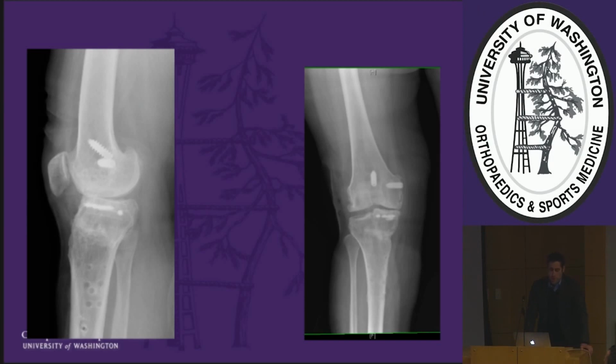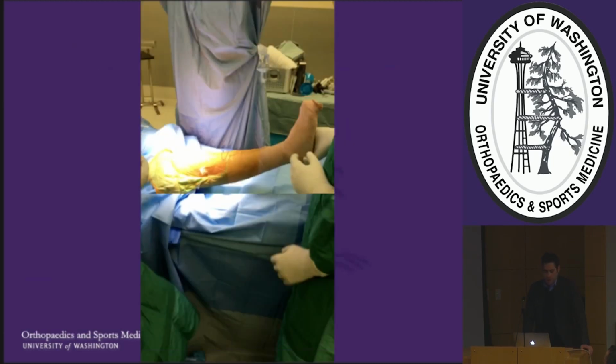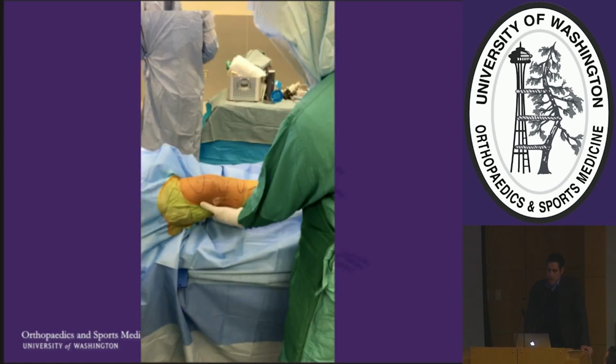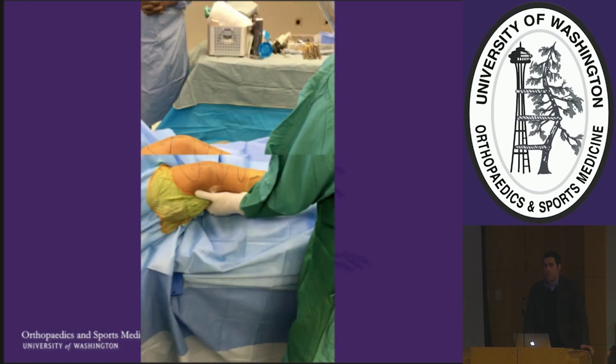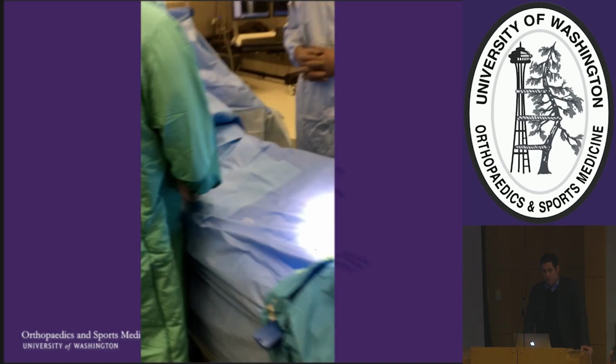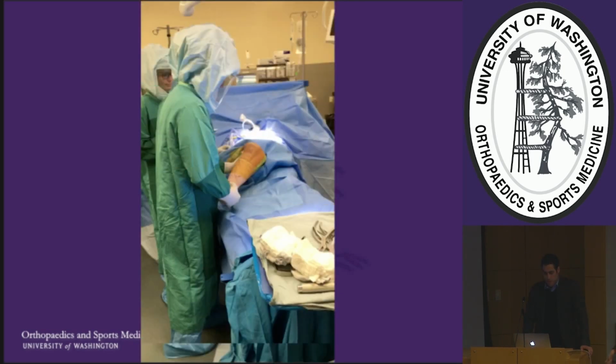This is a 30-year-old gal that had unfortunately been hit by a car, had a multiligamentous injury, then had a valgus osteotomy which failed, but her alignment was gravely distorted by the osteotomy, and it didn't provide us with reliable landmarks that I felt would give me enough accuracy using standard instrumentation. She also had a lot of ligamentous laxities you'll see here on her preoperative exam. And so this was a patient that's 30 years old that I wanted to make sure we got the components exactly where we wanted them. And you can see here how much valgus she will go into with a stress.